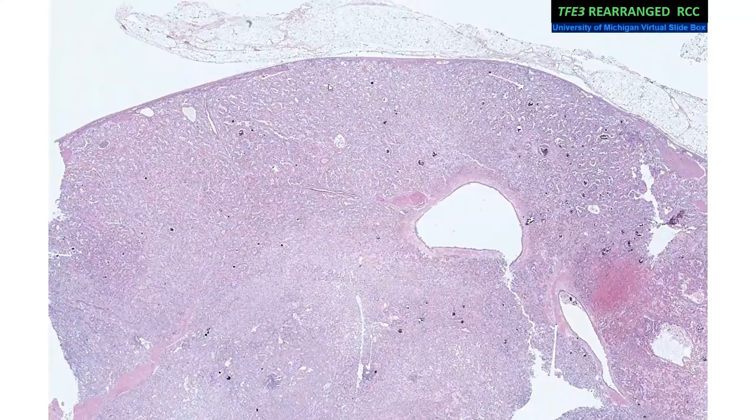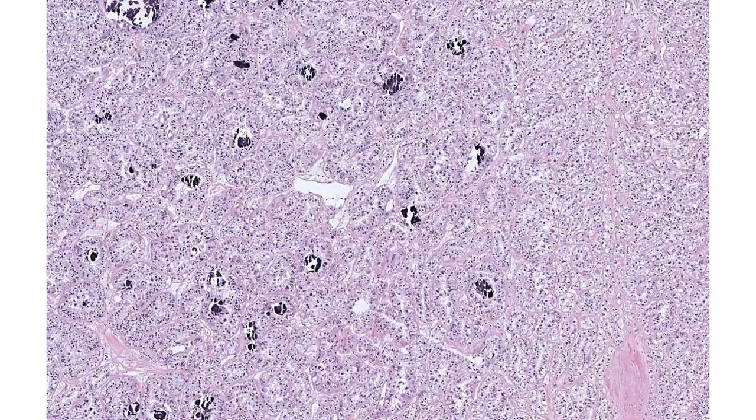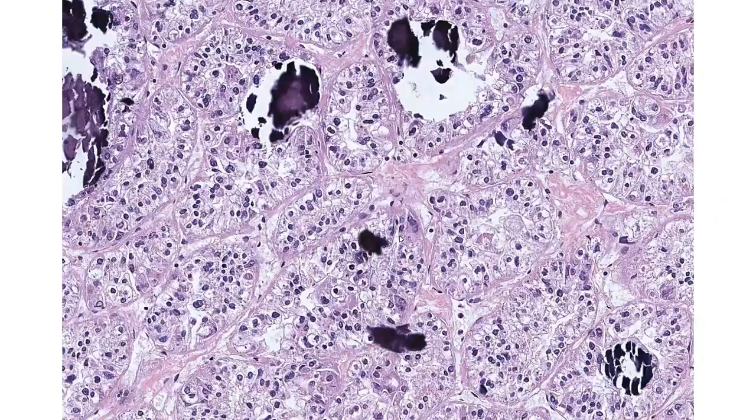Now, this is a case of a TFE3 rearranged RCC, wherein you can see that the cells are mostly arranged in the form of coalescent irregular tubules and nests. Overall, the cells have a pale clear cytoplasmic appearance with a bit of cytoplasmic eosinophilic granularity here and there. But one distinctive feature is the presence of these psammoma bodies in the background.